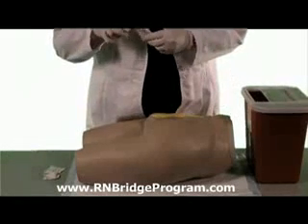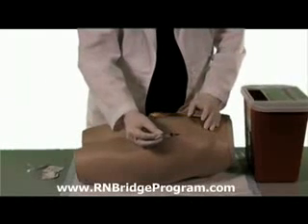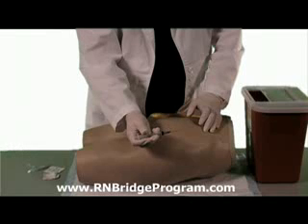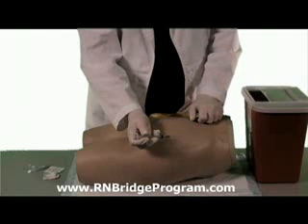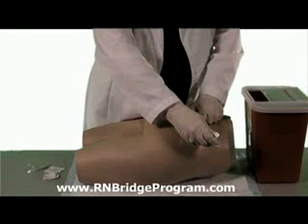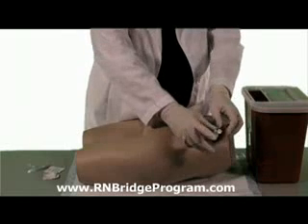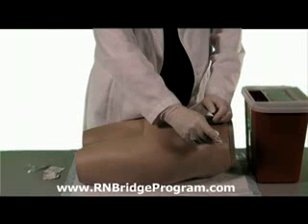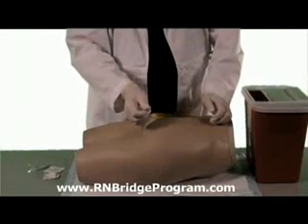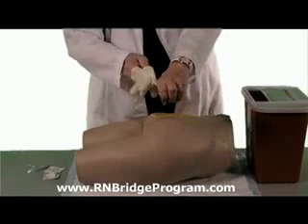Then you want to take your needle with your medication. You want to make sure that you turn the bevel up. The bevel is where the hole is in the needle. It goes up towards the patient. You are going in at a 90-degree angle. Directly in, aspirate to see if you have any blood, and then immediately inject. When you finish, pull your needle out, put it in the sharps container, take off your gloves, and then you're done.